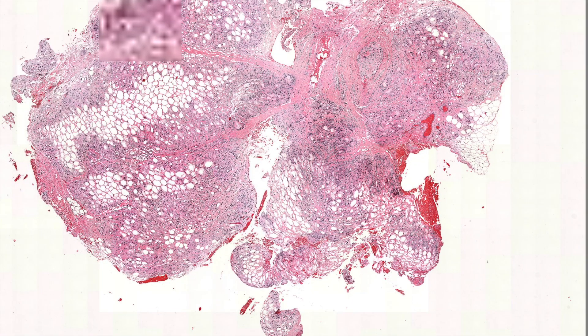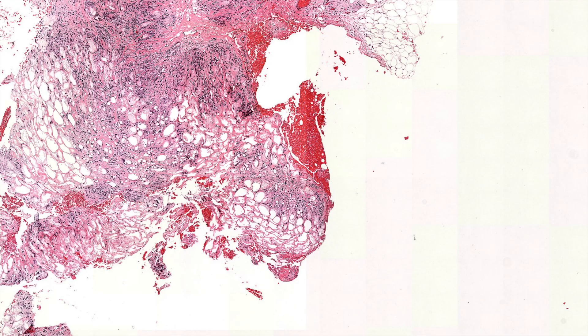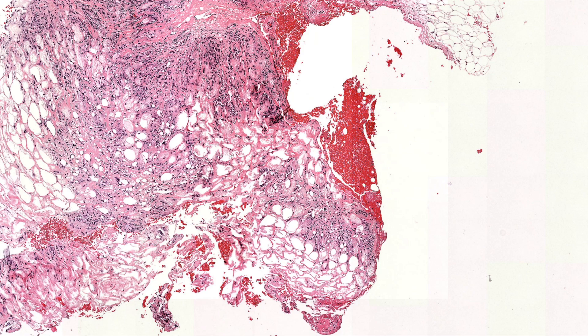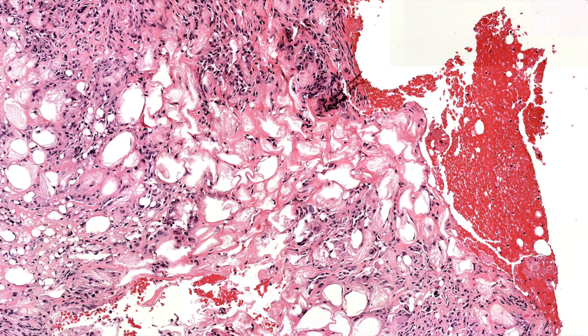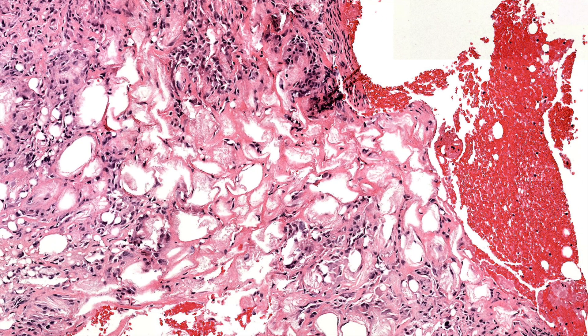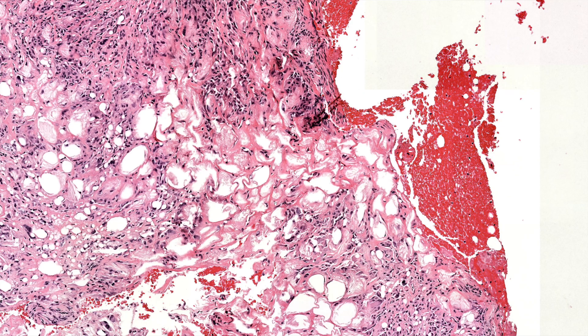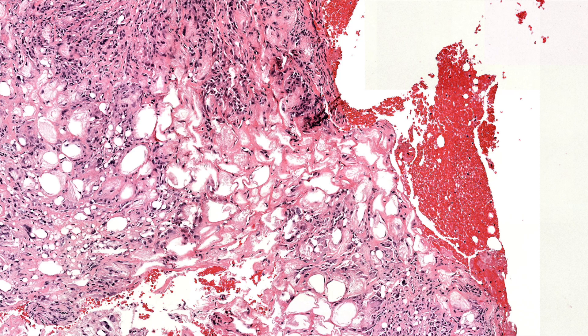For testing purposes, remember to look up and learn about sclerema neonatorum. It's very rare and very bad. Microscopically it's not super dramatic — the clinical context is really what's important in diagnosing it. Also, look here — we almost have a little arabesque pattern, like you see in lipodermatosclerosis. You can see a similar arabesque or membranous lipoatrophy pattern in other diseases beyond lipodermatosclerosis — we'll talk about that later.